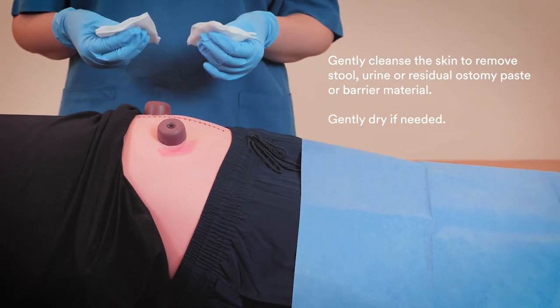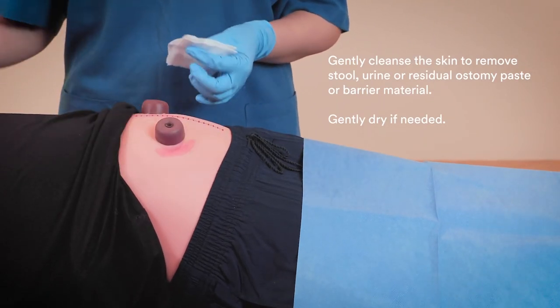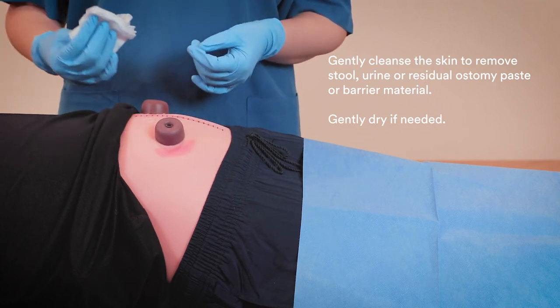Gently cleanse the skin to remove stool, urine, or residual ostomy paste or barrier material. Gently dry if needed.